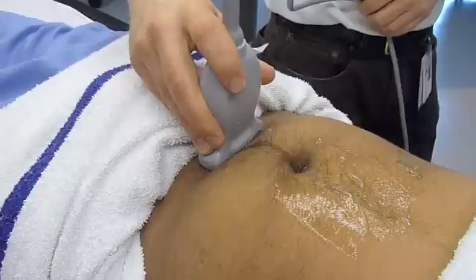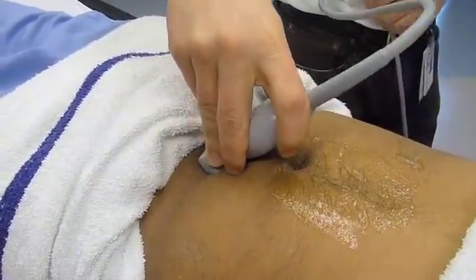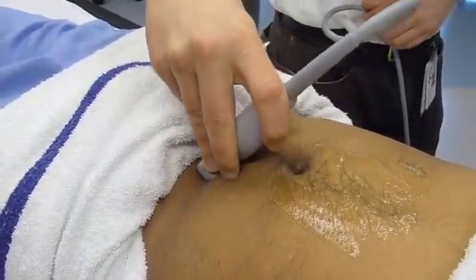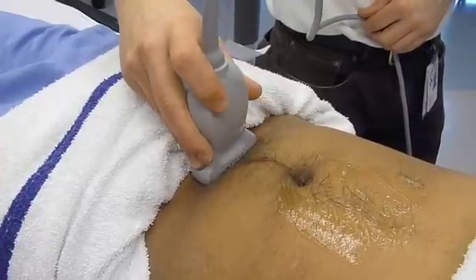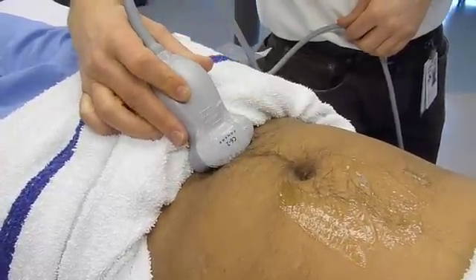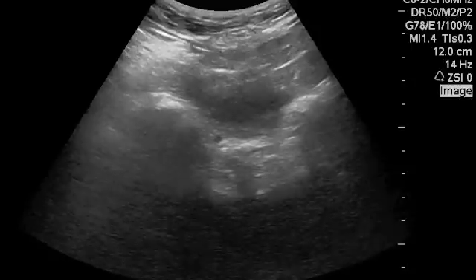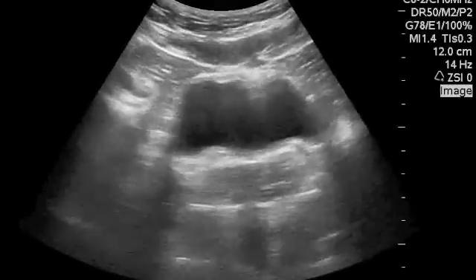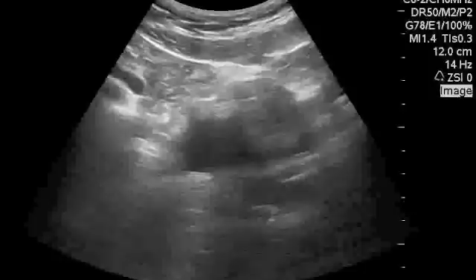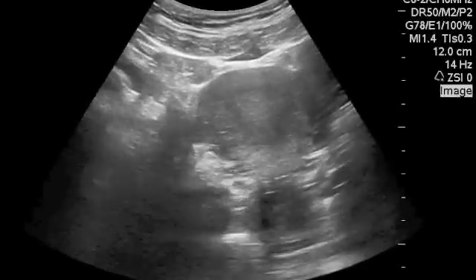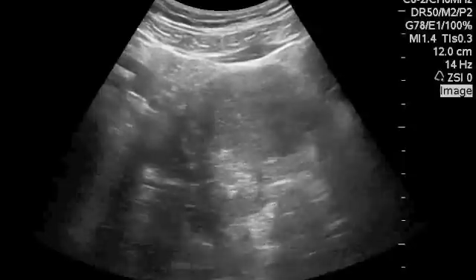Let's look for free fluid in the pelvis. Position the probe about one centimeter above the symphysis and look right down at the patient's feet. Then slowly sweep back until you see the bladder appear and completely disappear. Fluid usually appears behind the bladder or between the uterus and the rectum in the female patient — there's the uterus coming into view here and disappearing.